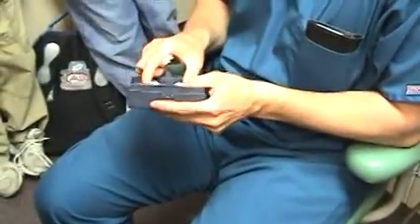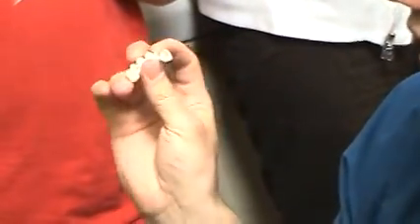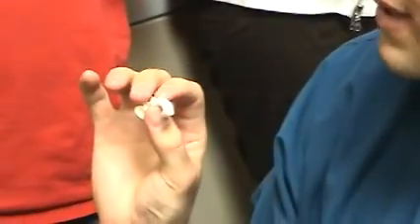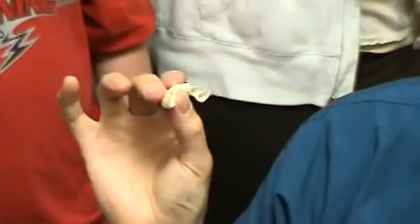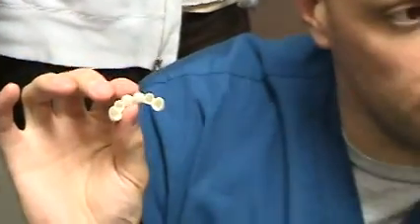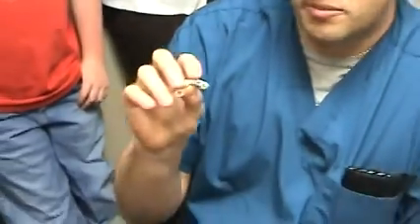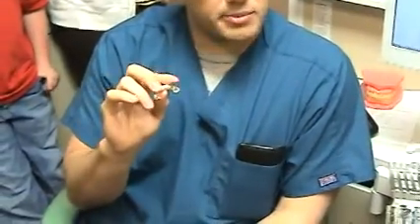All right, so remember we were talking about crowns and bridges. This is an example of a bridge. This is a high-end bridge. One like this would be very expensive, because as you can see, there's no metal in it. Nowadays in dentistry we have more advanced materials, and they can manufacture or mill this out of zirconia as the backing instead of metal.